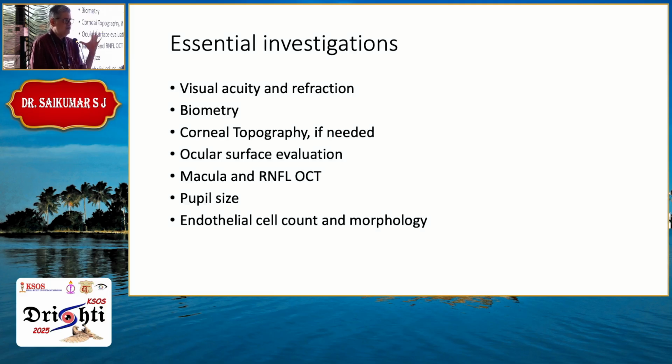Some essential investigations that have to be done in these patients are visual acuity and refraction, obviously, a very good biometry, preferably an optical coherence biometry. I don't use topography for every patient, but if needed, I do.